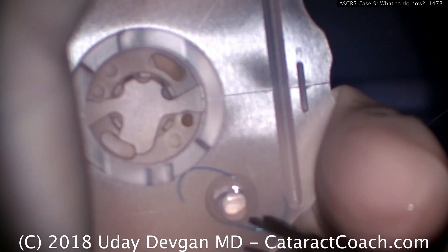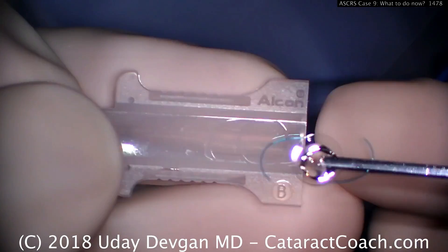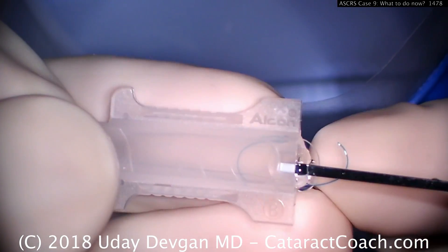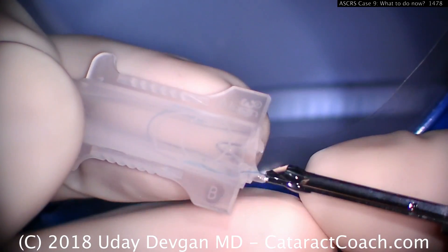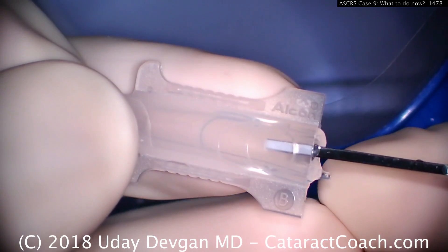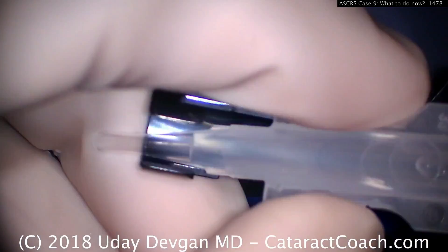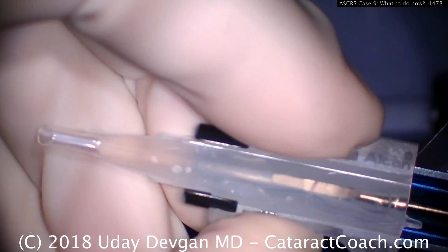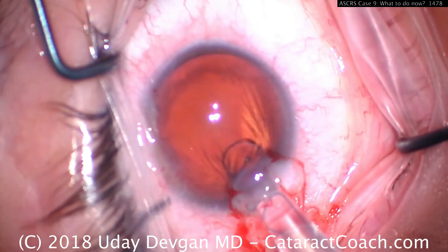There's the lens — I'm going to grab it carefully. As it goes in, there's the correct orientation — there's the picture on the box. Leading haptic is correct. Push it in a little more; put that haptic on the other side of the peg. This is a cartridge meant for a three-piece lens. Now put it in the injector and advance the plunger — but watch the leading haptic as it goes in the eye.